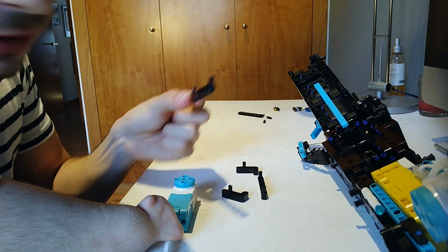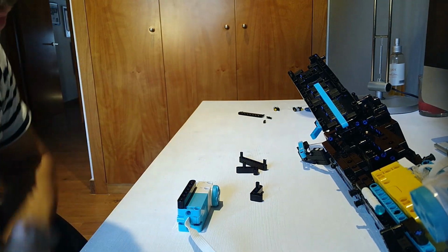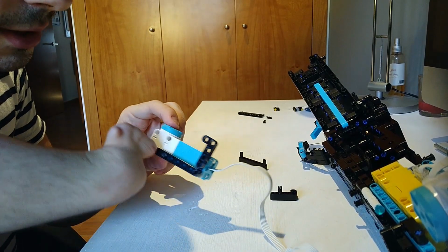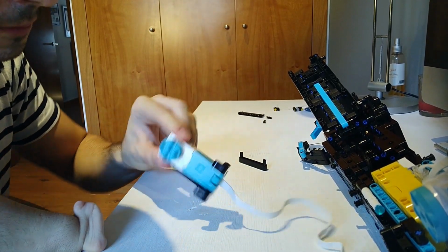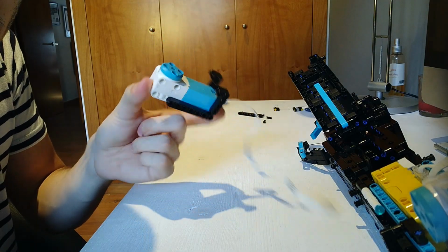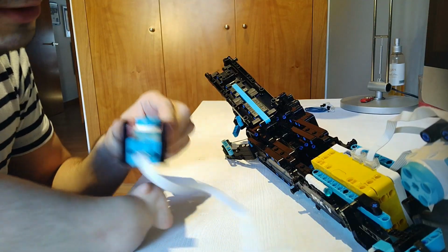Okay, so once we remove the bricks from the prosthetic, we need to connect them in order to fit the interior of the prosthetic, like this. And like this, forming like an L shape. And it's the same on the other side, so you have this brick right here that goes up. And you should be able to make this with the bricks that fell off of the prosthetic. And now you are going to connect these bricks the exact same position that they were before.